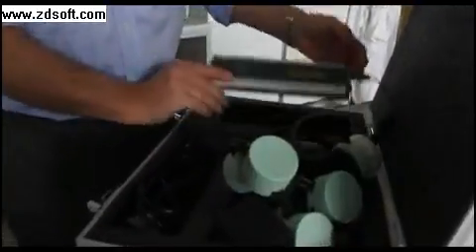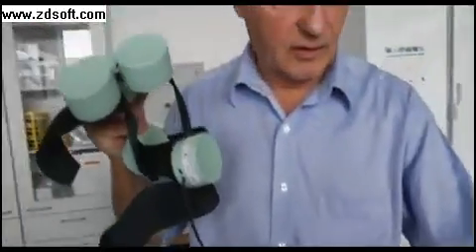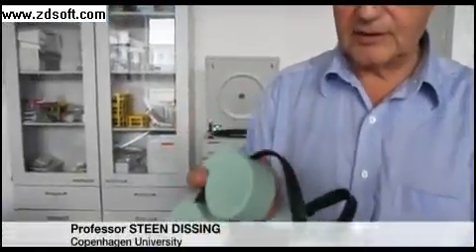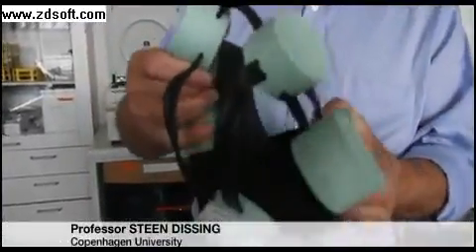With the coils and with the pulse generator that creates the pulses for the coil. And what the patient will do is take the coils and place them on top of the head in such a way that those coils we're seeing here are activating particular parts of the brain.